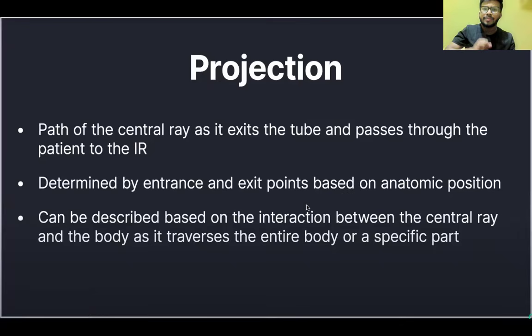Hi. In this session, we are going to discuss the radiographic projections. What is an AP projection? What is a PA projection? What criteria do we use to give a name to a projection? We give a name to a projection based on the entrance and exit point of the central ray, that is, the X-ray.